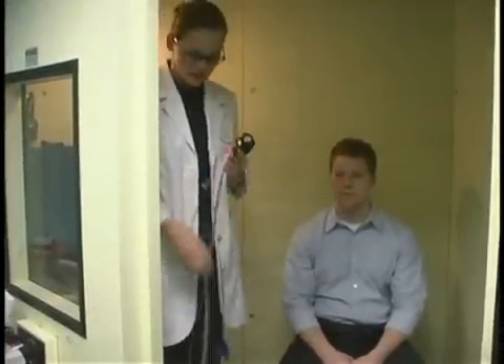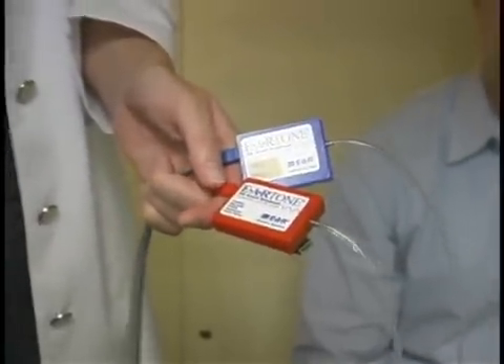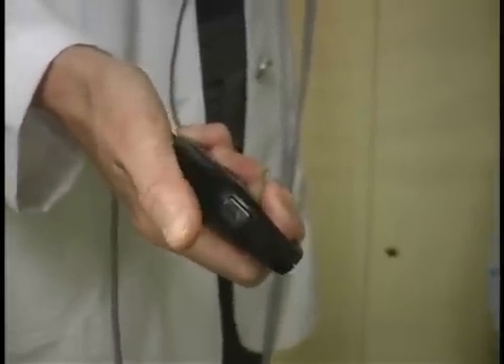The next part of the assessment is to evaluate the hearing sensitivity. This stage involves listening to some sounds at different pitches. If you think of it like notes on the piano, the person receiving the test will hear a variety of different notes. What they are required to do is let me know what the softest sounds are that they are able to hear. They can respond in a variety of ways — some people will raise their hand, but in this case we have a button and the client can push the button each time they hear the sound.